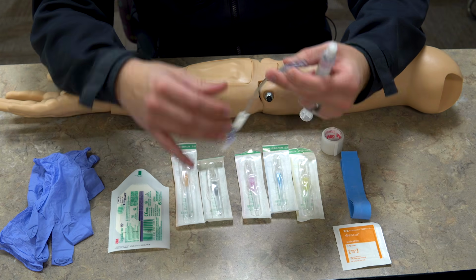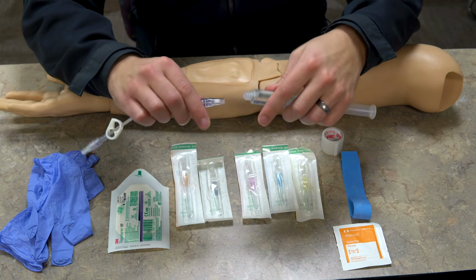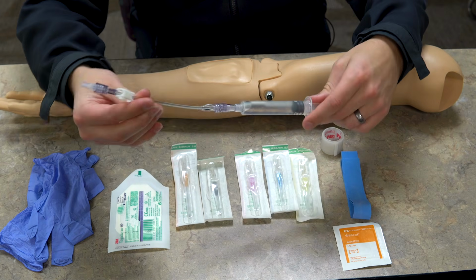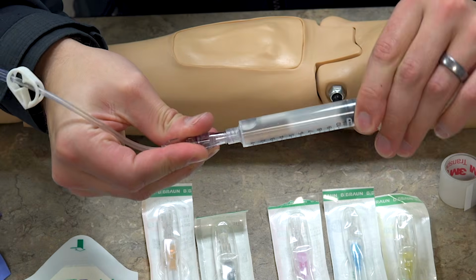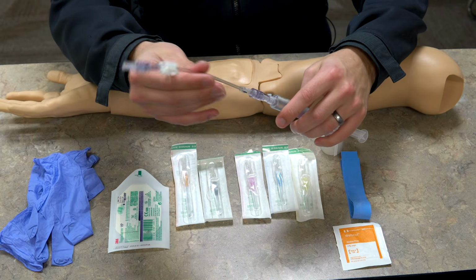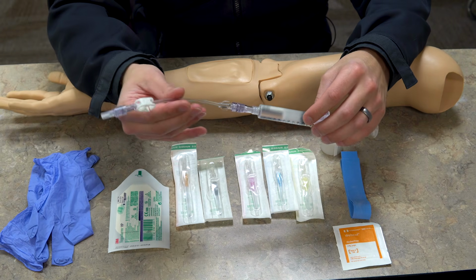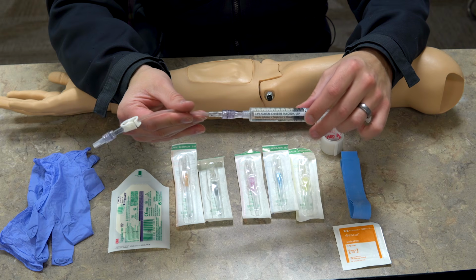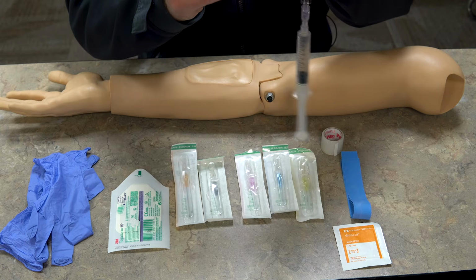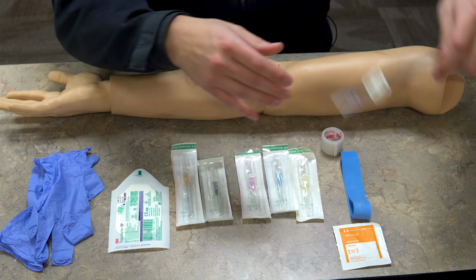So to get this ready, you take it out of the packaging, and there's a lot of nuances to IV starts. I'm not going to cover everything, it just can't be done in a short video, but I'm going to try to hit everything we can. So you're going to take the saline, screw it onto the luer lock here, and then I'm gonna flush that line. I wanna get all the air bubbles out of this catheter until I have the saline coming out the end. This is gonna be used to confirm that we have the IV in the right place and then remove any clots that might form. This end here has a cap on it. We wanna keep that cap on as long as possible because this end is sterile. I'm gonna set that aside.